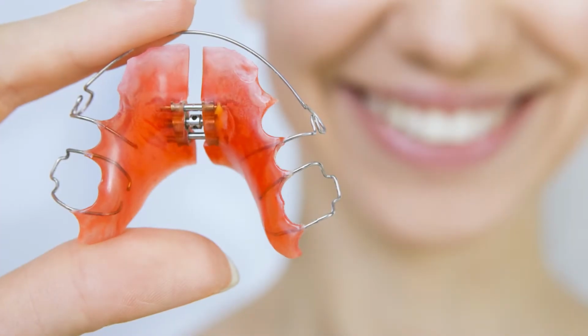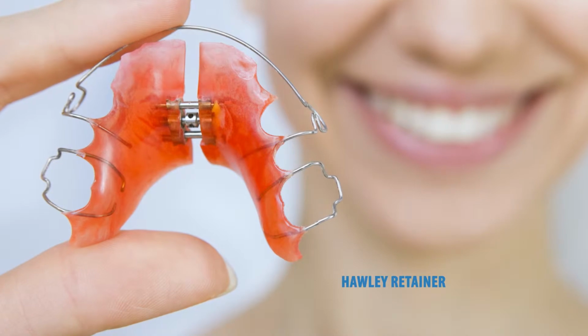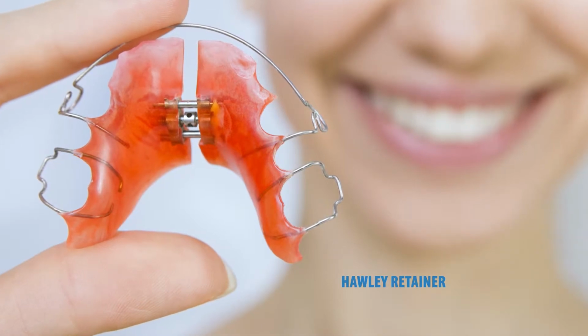The older traditional retainer that we had, with the acrylic and a wire that went across the front, is called a Hawley Retainer. We really don't use those a lot today, just depending on the result of the case. If we need settling in the vertical dimension, we can often do that. Even with an Essix Retainer, we get some vertical settling, but sometimes we have to use a Hawley Retainer in order to settle things.